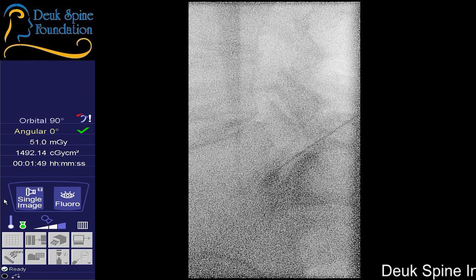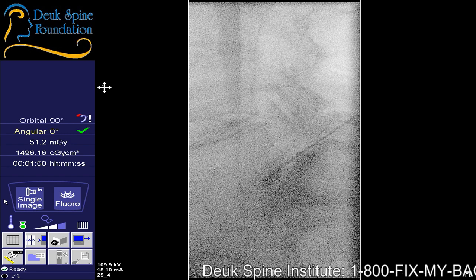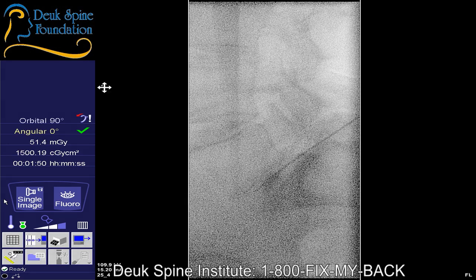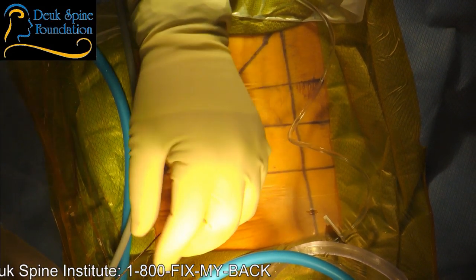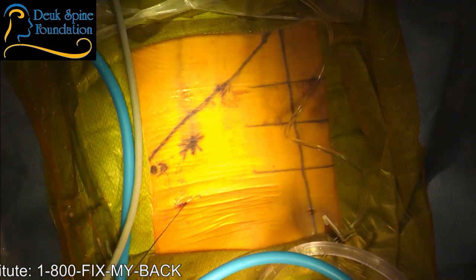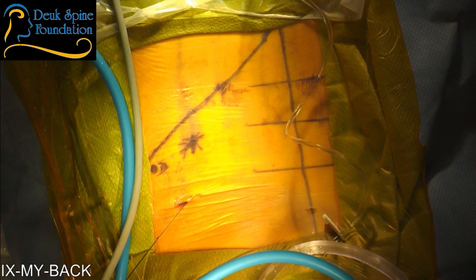Shot. All right, that's better. All right, so I placed the guide wire through the needle. I'm going to bring the needle out. Shot. I can still see the guide wire. I can see the tip of the guide wire, which is very important. You don't want the tip advancing. You don't want the tip going back. Any movement of the tip is bad, except for a few millimeters. Shot. All right, it looks good.